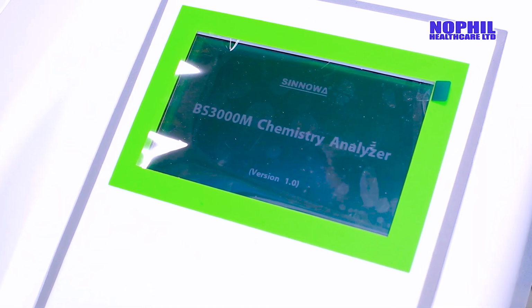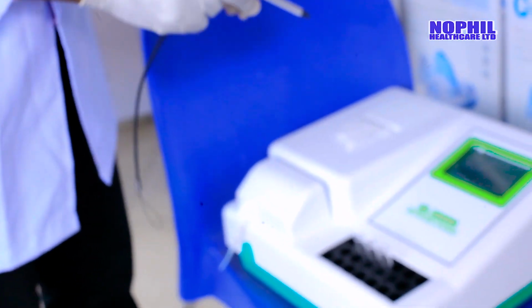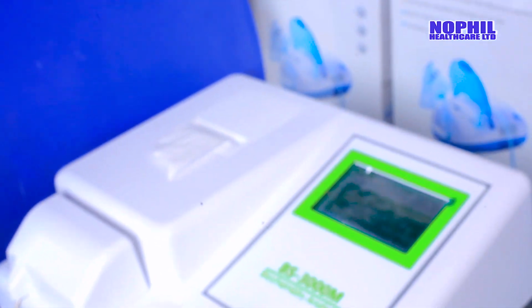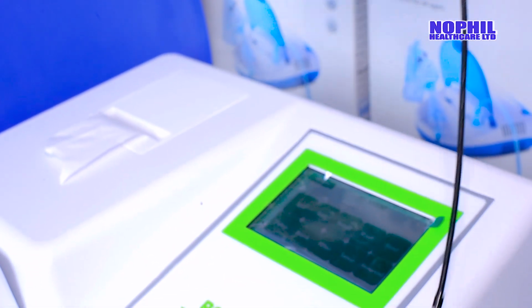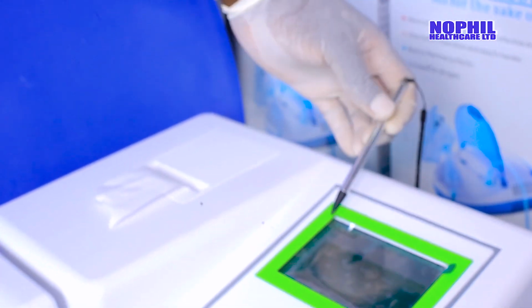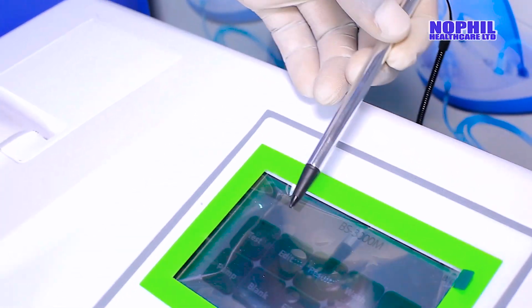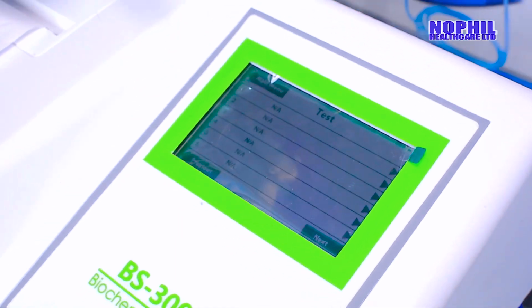The machine has got the pen touch. This is to avoid cross-contamination. You just use it. It is a touch screen. You just click once. It can now come to the display, and what it does, you can be able to see. If you want to perform a test, you can click test. If you want to edit, you can edit the test. This is when you want to do the test.